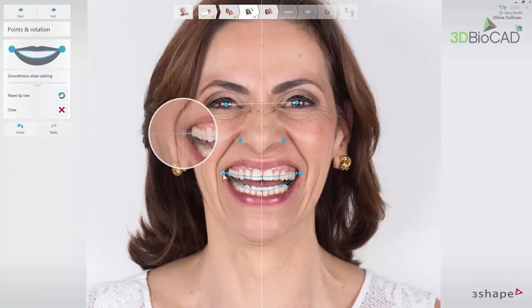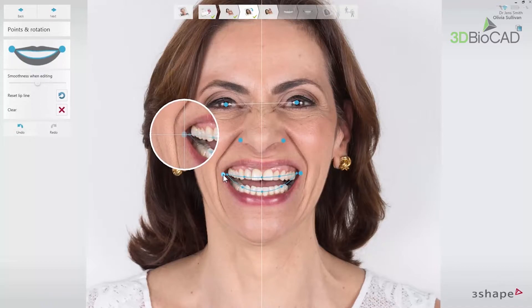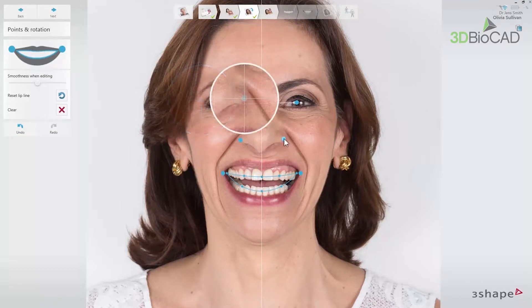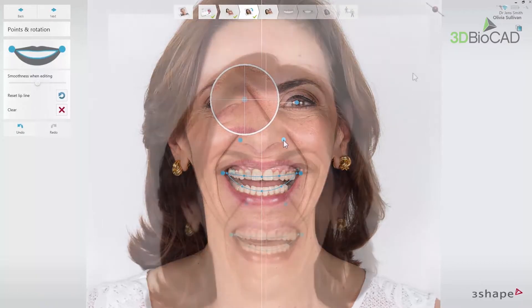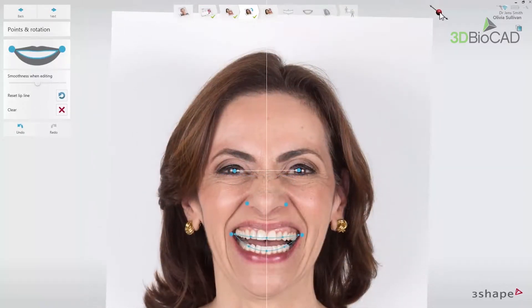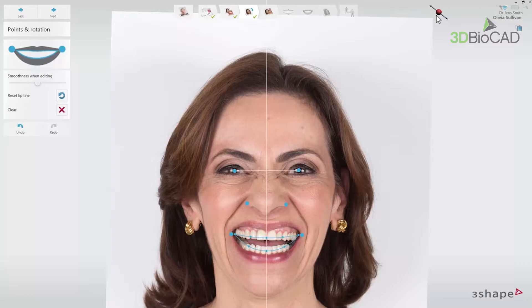The pupil and commissure points are used to align the picture by finding the horizontal balance between the points. The nasal wing points help to set the midline properly and to dictate the canine position. The points can be adjusted at any time if necessary, as well as the angulation of the photo. To start the placement afresh, use the clear button.